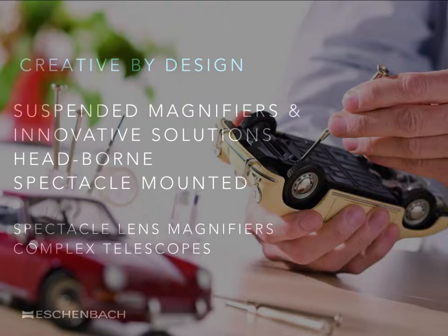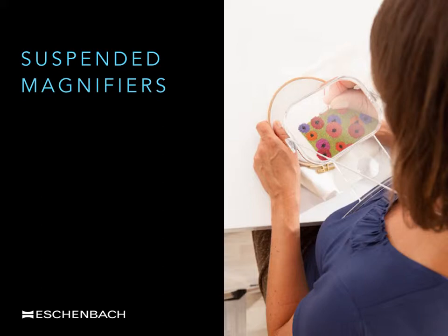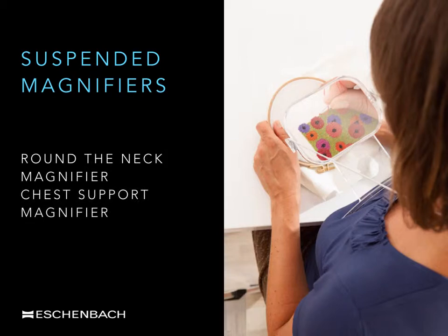Suspended magnifiers are also called round-the-neck magnifiers or chest support magnifiers. A suspended magnifier like this one is hung around the neck with a cord, giving two times magnification. It is especially popular with both sighted and visually impaired users, allowing both hands free for the task. The rubberized foam pads keep the magnifier from slipping over the user's clothing, and the transparent frame allows more light to reach the task and cuts down on annoying shadows from the wide neck or stem. The patient may wear either their distance or reading glasses and will adjust the position of their hands beneath the magnifier to find the most appropriate working distance.